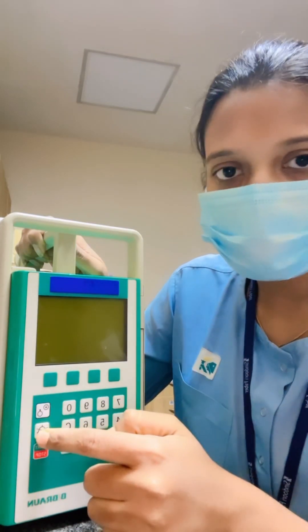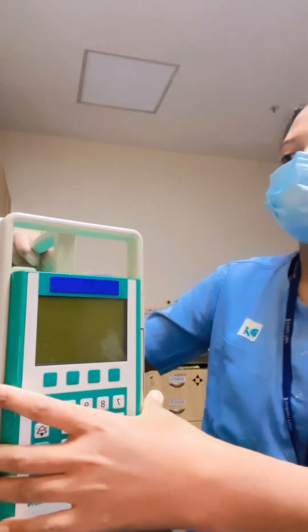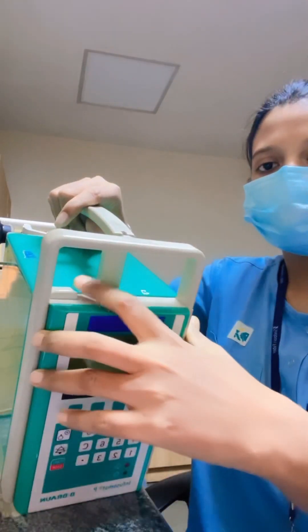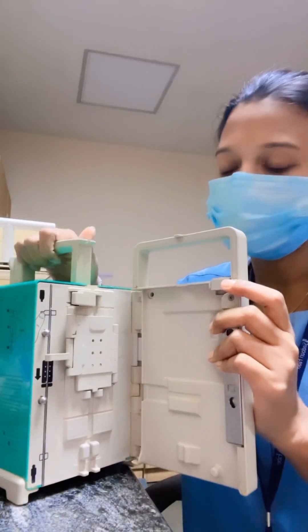This is the on/off button, this is the alarm silence button, and this is the start and stop button for infusing. This is the door lock — if you press this, the door will open. This is how it looks from inside.